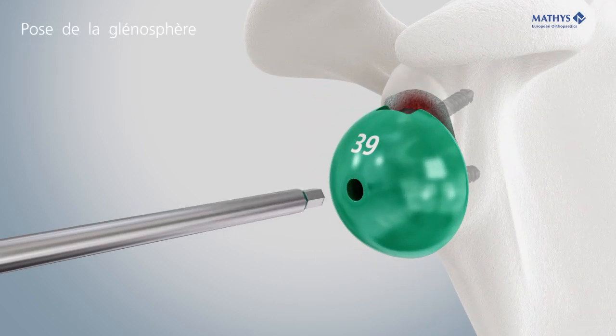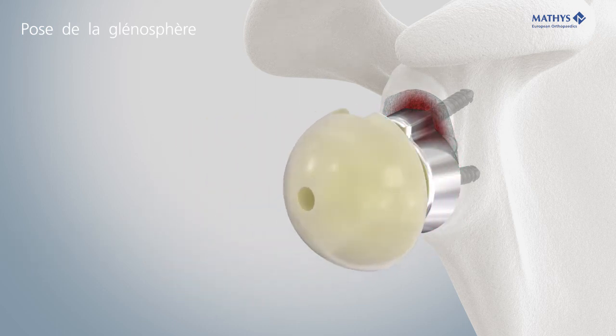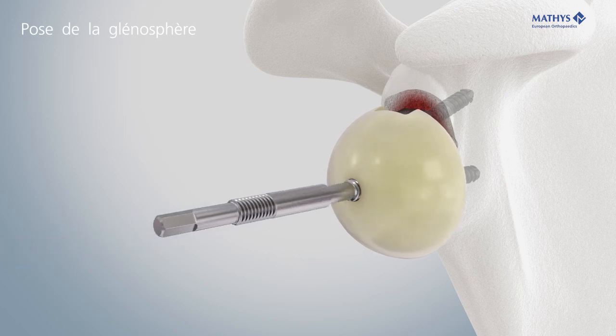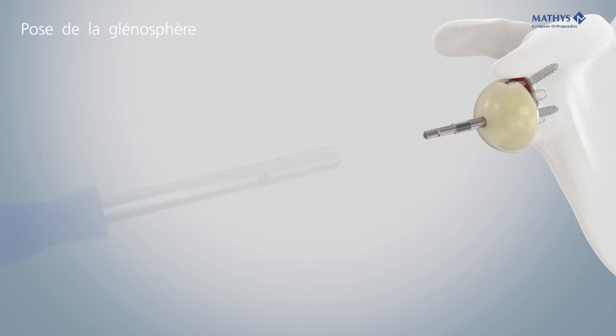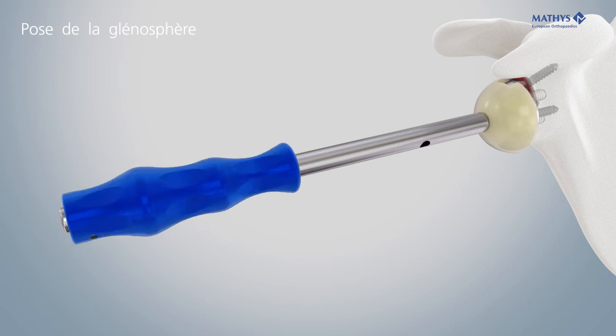After choosing the glenosphere and inlay sizes, place the definitive glenosphere into the metaglene. Screw in the metaglene assembly rod and then screw the glenosphere pusher over the metaglene assembly rod. This will snap the glenosphere onto the metaglene.